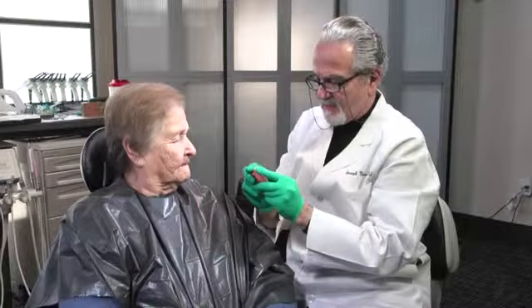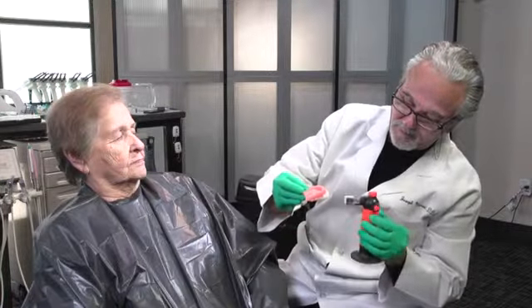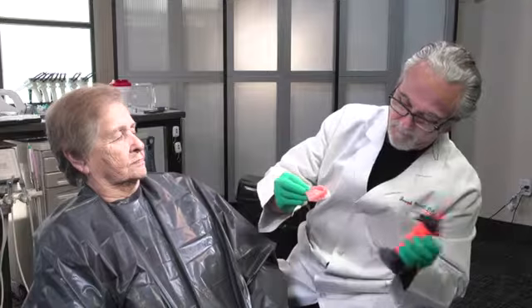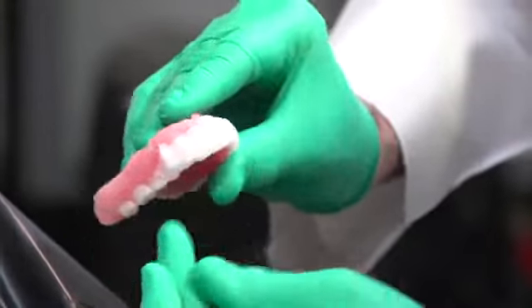To adjust a section of the dental shells, use a mini torch to gently heat the small ridge between the shells to allow fine positioning. You can move several teeth at a time or just a single tooth to fully customize the arrangement.